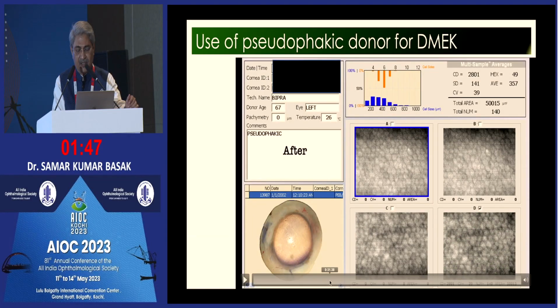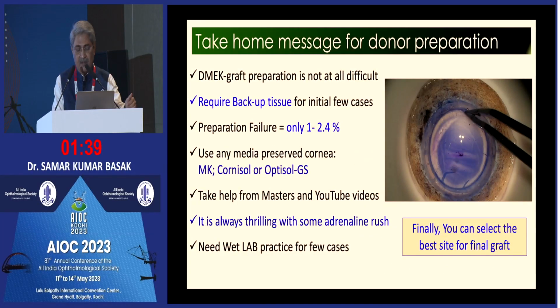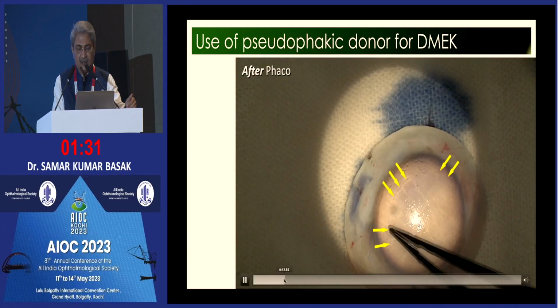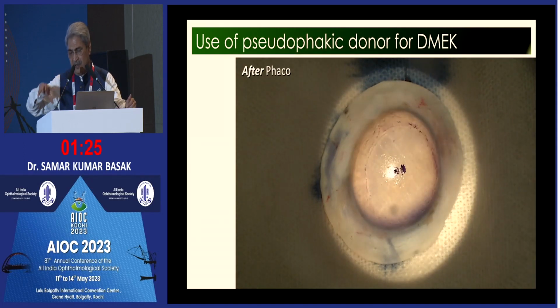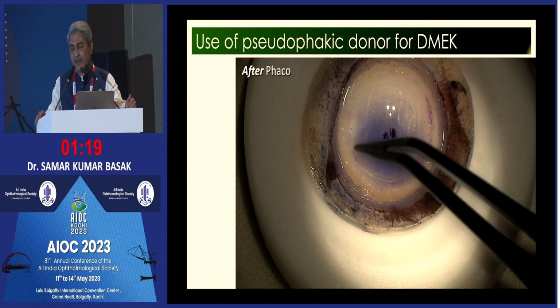So you see where is the mark of incision. You see the mark of incision from externally, you go eccentric, just this template mark towards the eccentric region. From inside you can also notice the area of marking.